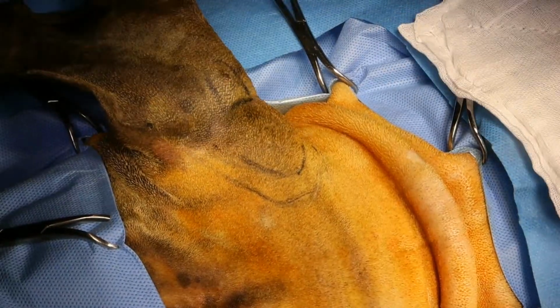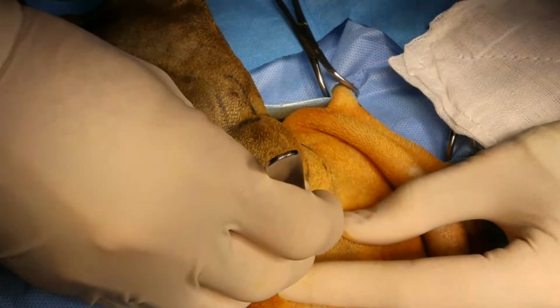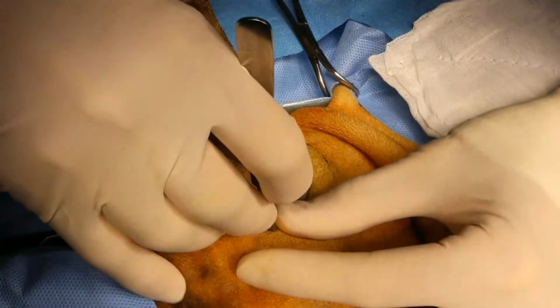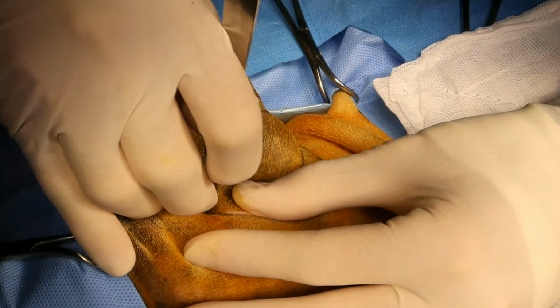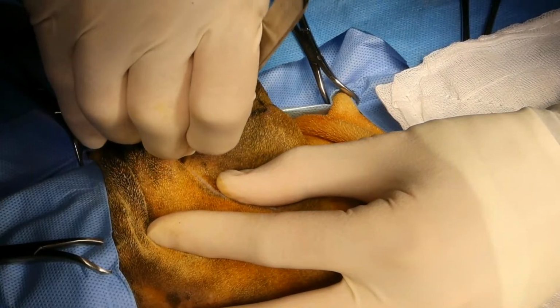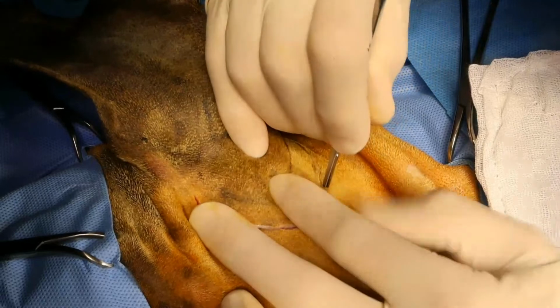So mast cell tumor is sitting here, so I'm going to start my dissection with a margin. I've done a CT scan, so it's fairly discrete, and so I'll start my incision up here. I'm going to go through some muscle layers, which are going to provide my deep margin.